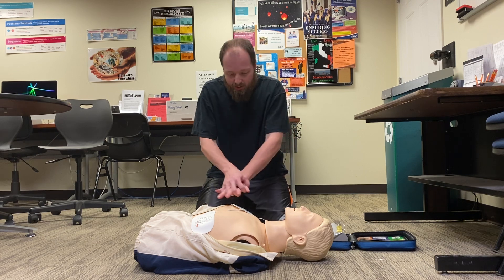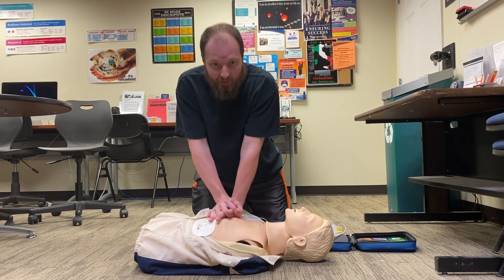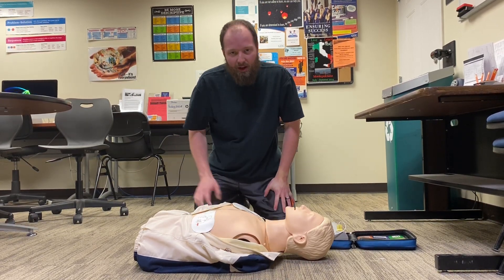Then the AED will tell you to resume compressions, and you go right back to your 100 beats per minute, at least two inches, until the AED instructs you further or further medical help arrives.